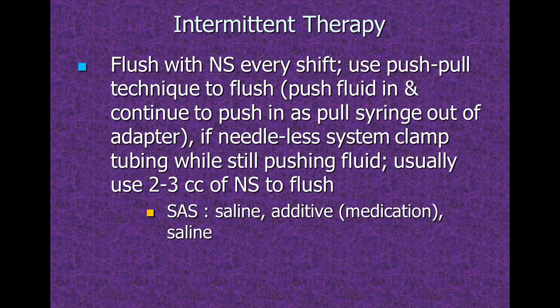When providing IV boluses, especially with medications, we use the technique called SAS, saline additive saline. So you would give saline through the IV line, then administer the medication, which would be that additive, and then clear the line again with saline. It is important to know how quickly you can give an IV push so that you do not promote medication toxicity.